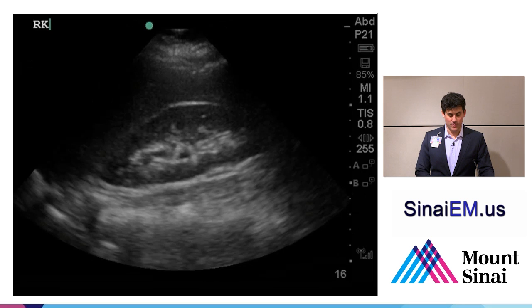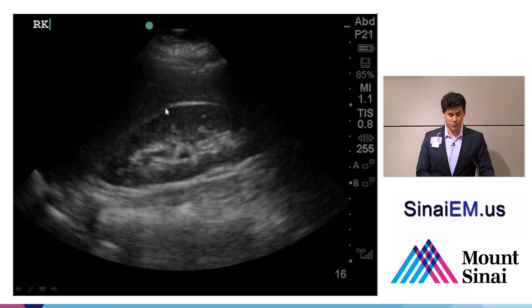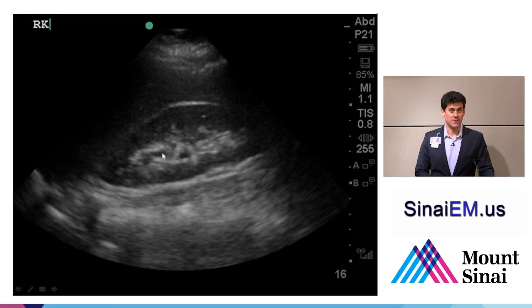Here again, we see the liver in the near field acting as a window for the acoustic energy. The next thing we see is this bright white Gerota's fascia surrounding the kidney — outer cortex, inner medulla, collecting system as these dark areas here.